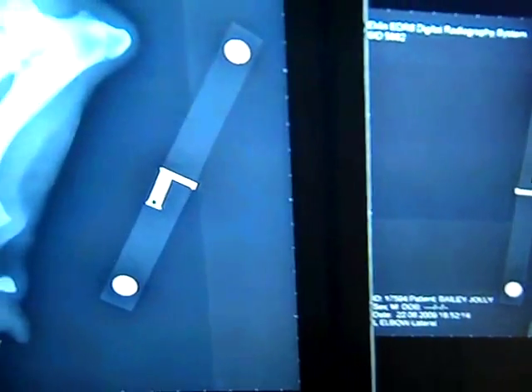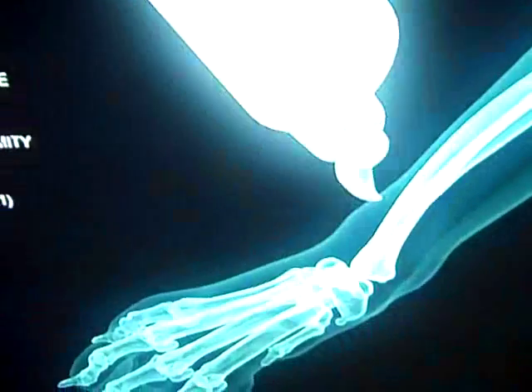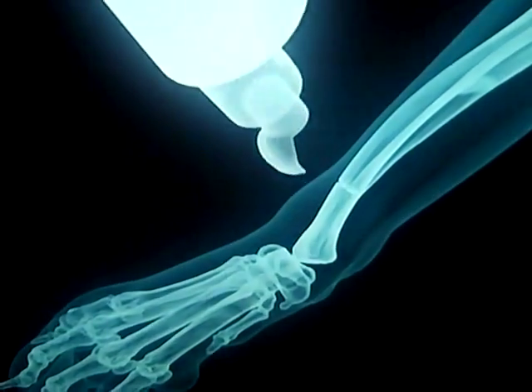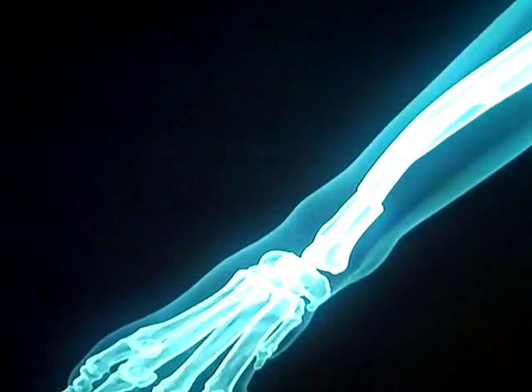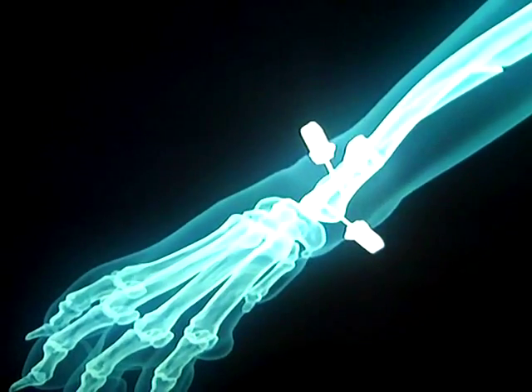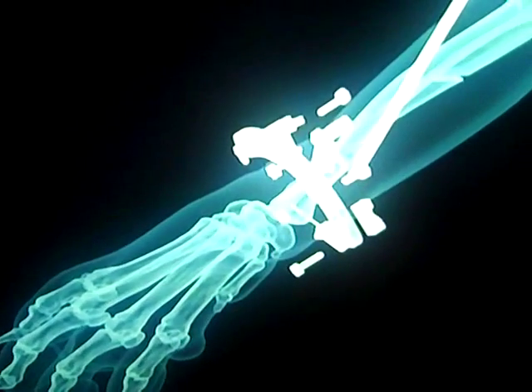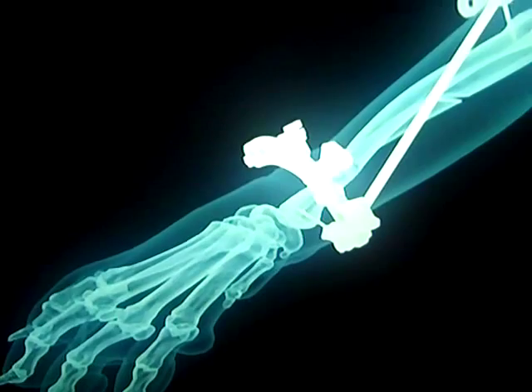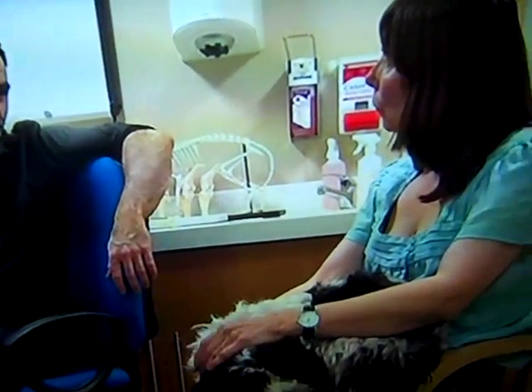Good boy. In an operation to correct Jolly's condition, Noel will attempt a new technique to treat a bone growth deformity. He'll cut both bones and use a specially shaped tool to help him correct and straighten them. He'll then attach 2 uniquely engineered frames, which will have to stay on for several weeks to keep the legs straight until the bones have healed. It'll demand real courage from Christine and bravery and perseverance from Jolly.